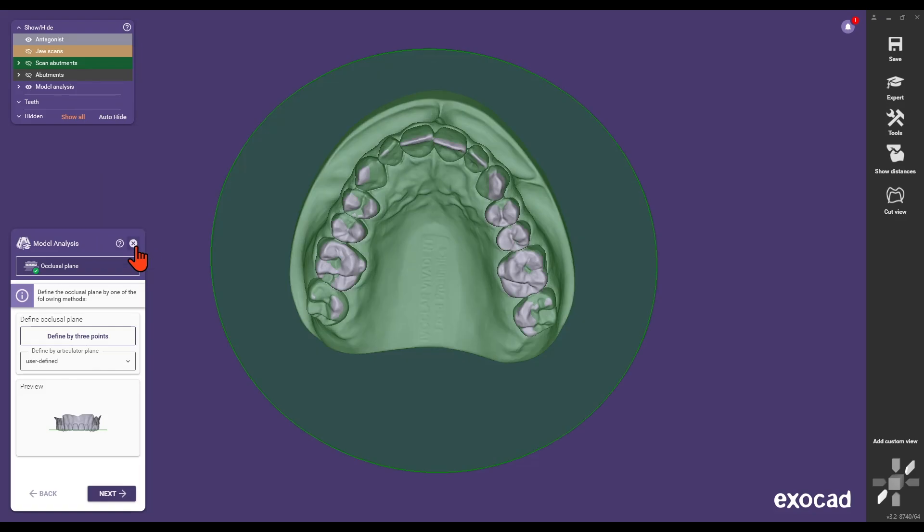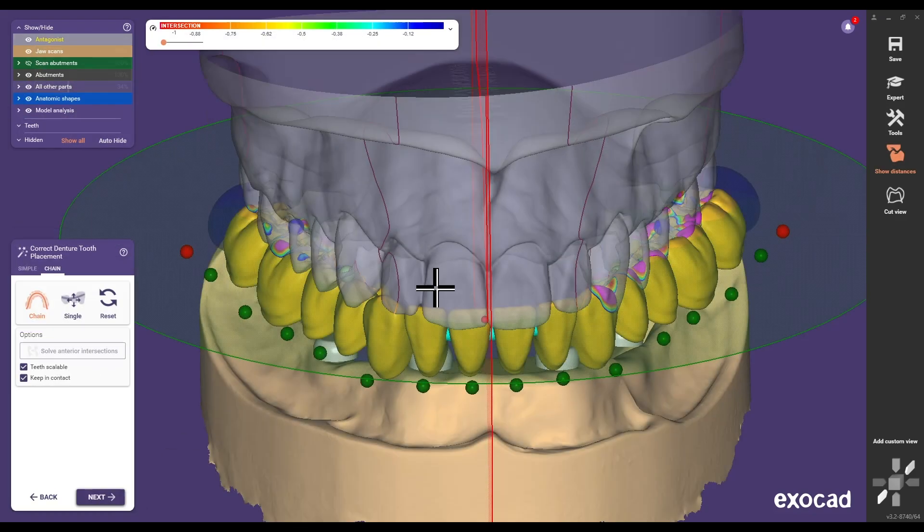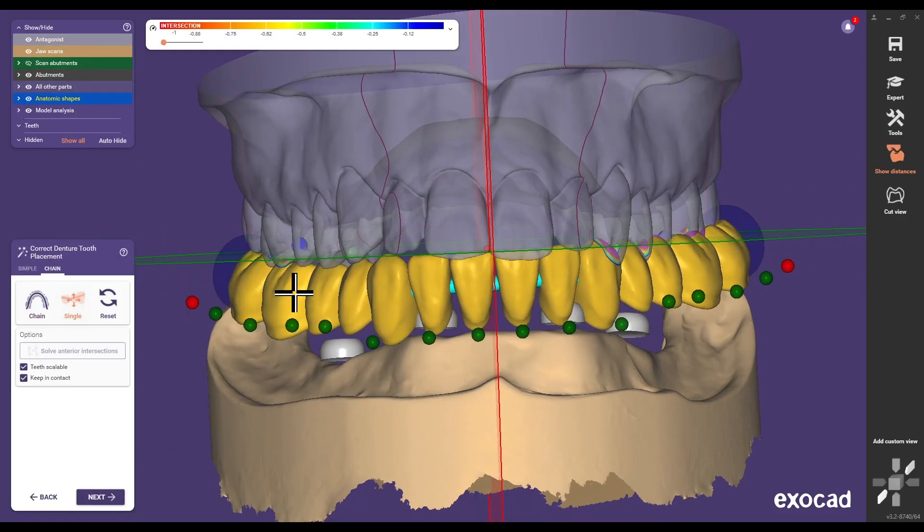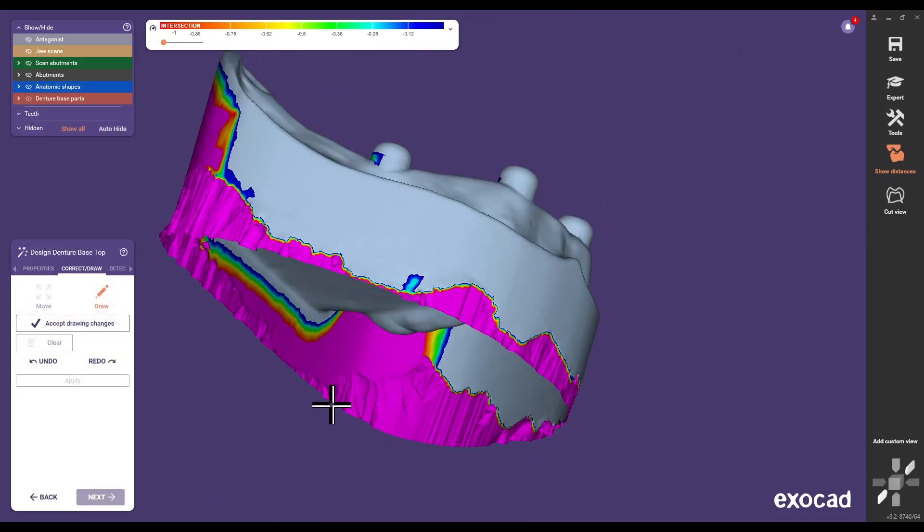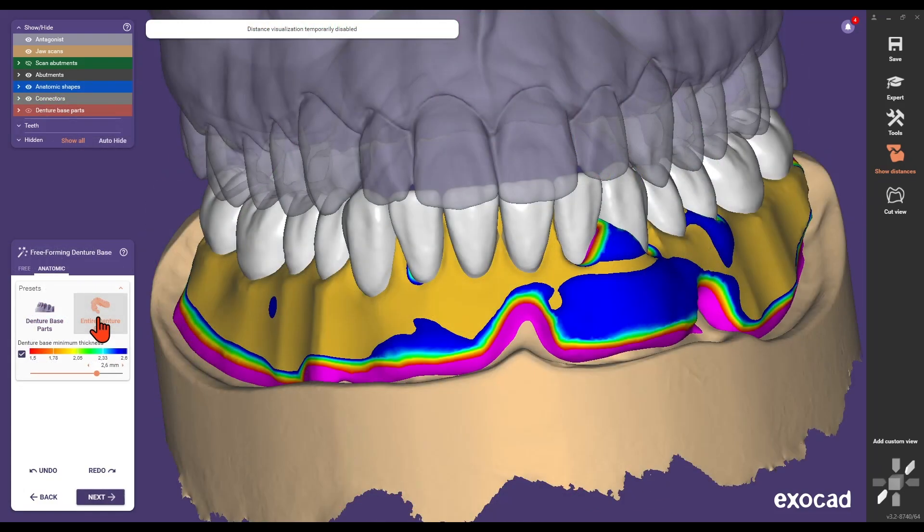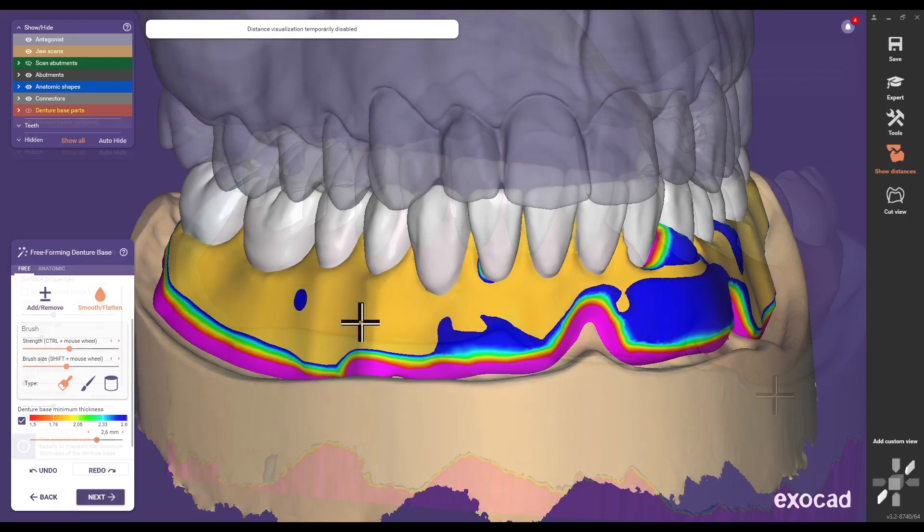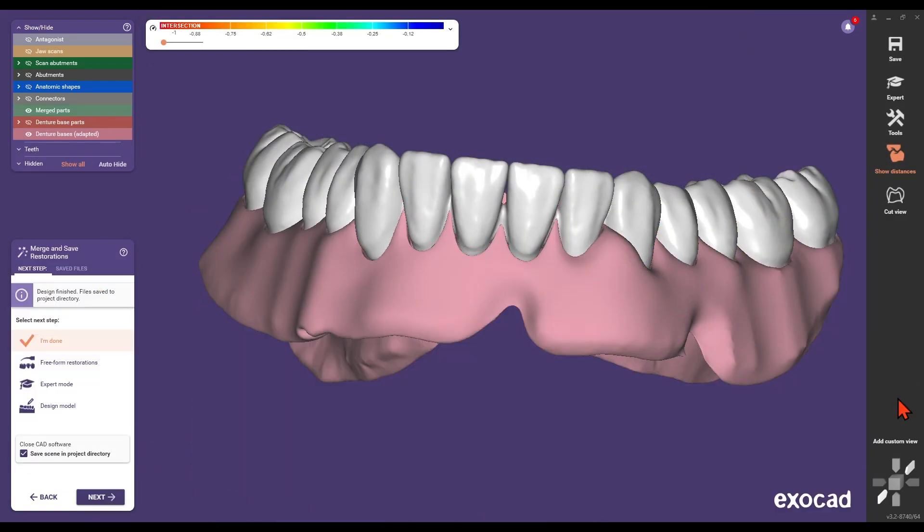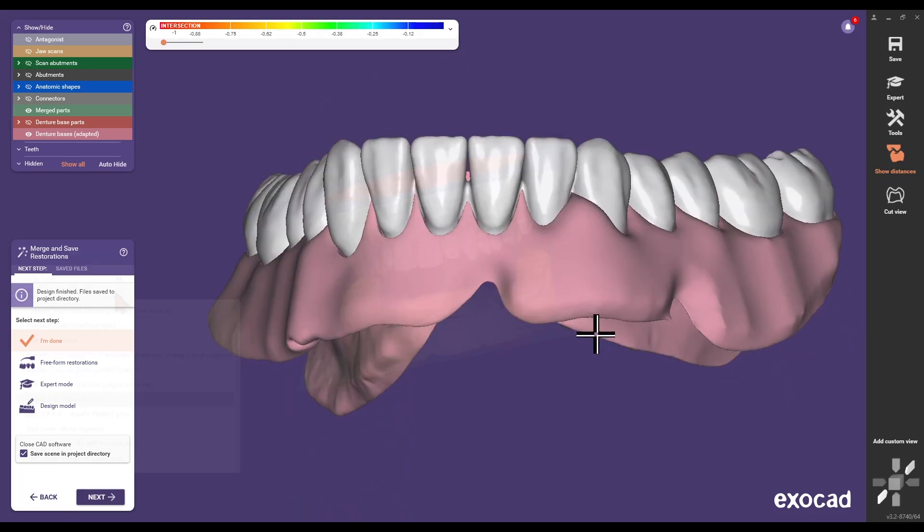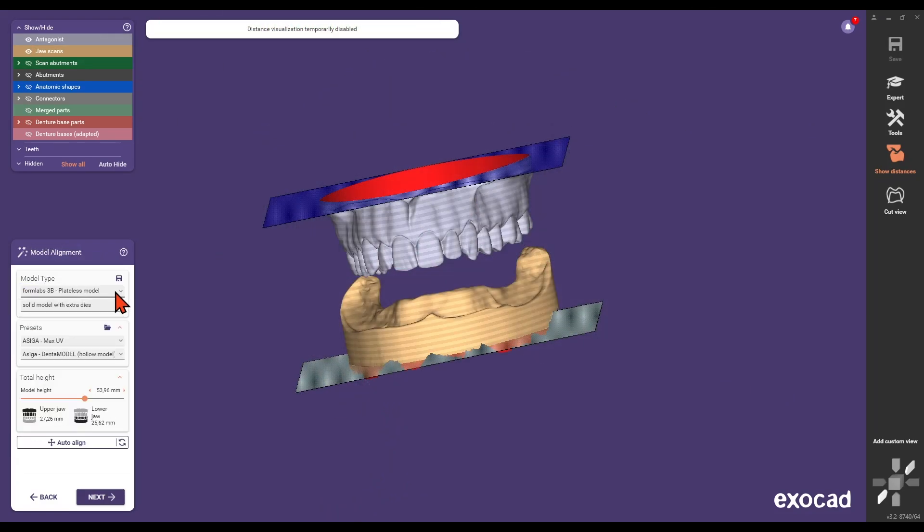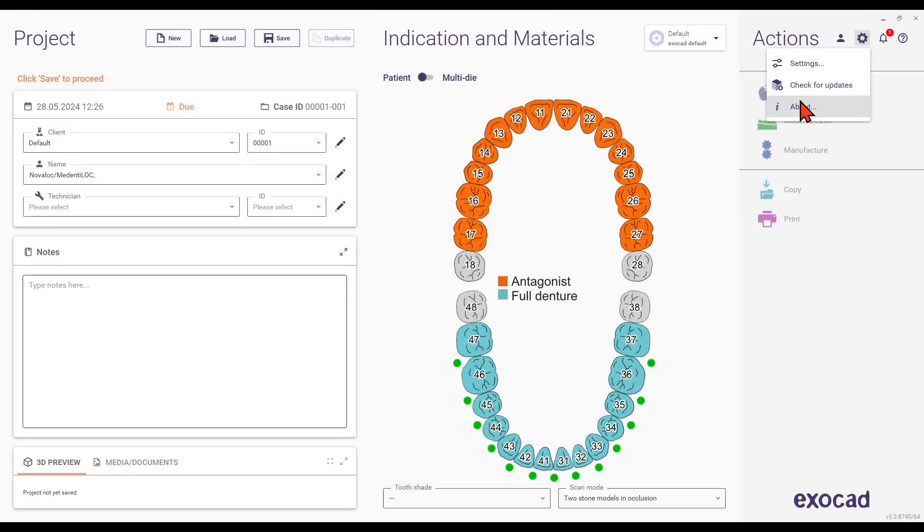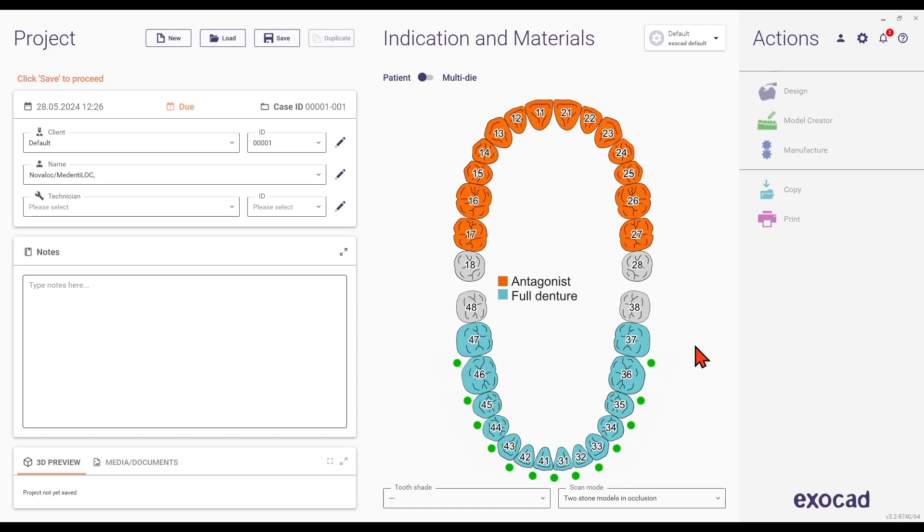Welcome to our step-by-step tutorial on using the NovaLock and MedentiaLock library for the abutment level workflow in ExoCAD DentalCAD. This video will guide you through creating a prosthesis on implant-based NovaLock and MedentiaLock abutments, ensuring a precise and efficient workflow. Please note that the NovaLock and MedentiaLock library is compatible only with ExoCAD DentalCAD version 3.2 LFCINA and later.